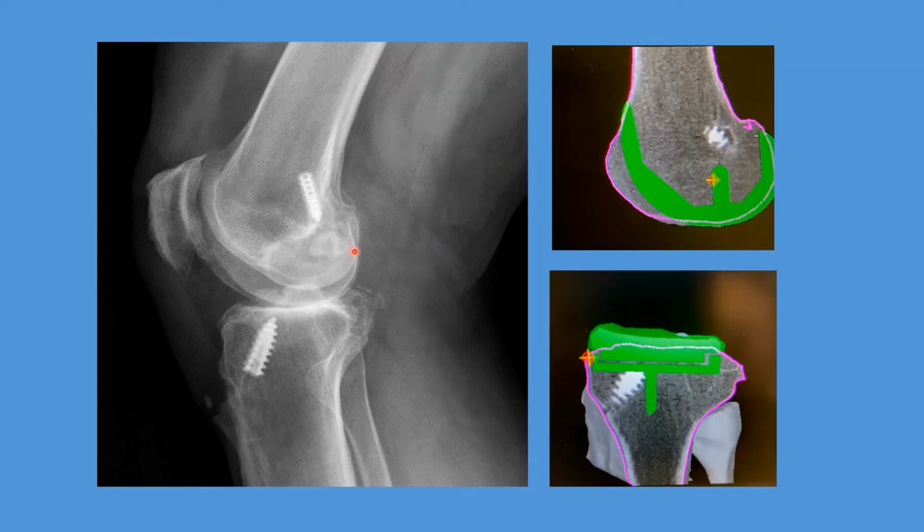Now, the tibial interference screw here is in a very different position as relates to the knee replacement compared to the femur. We saw in the femur, this pin is out of the way of the implant. However, this screw impinges directly with the implant. So even though this screw is buried within bone, it will need to come out, or it will block the placement of this implant. And we need to know this ahead of time. So we know we have to go after this one. This one we'll leave alone.